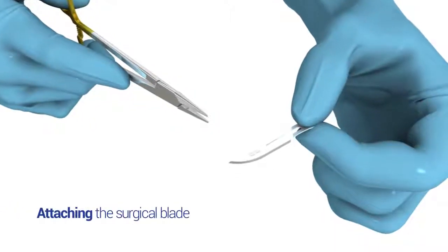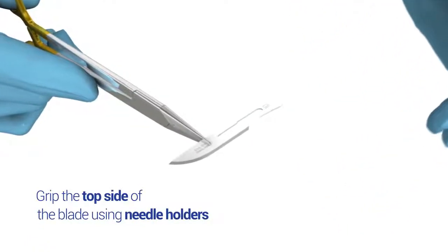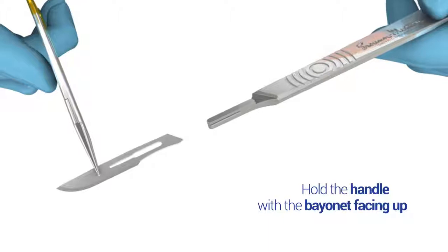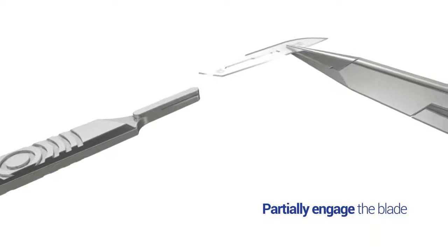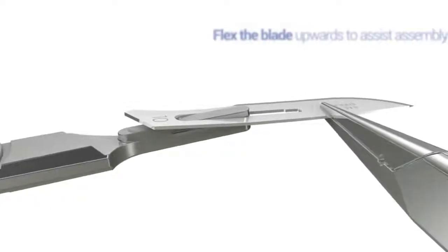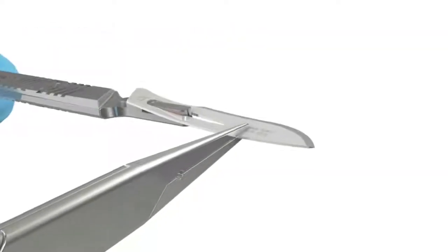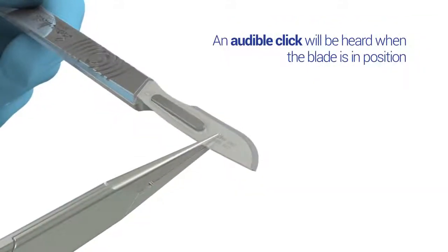When attaching the surgical blade, you should grip the blade with needle holders on the top side away from the cutting edge, thus avoiding any damage. Hold the corresponding handle in your other hand with the bayonet facing up. Align the slot in the blade with the fitment on the handle and partially engage the blade. To assist assembly, flex the blade slightly upwards when sliding it onto the handle. Slide the blade back until it clicks into position. The blade is now securely attached to the handle and is ready for use.